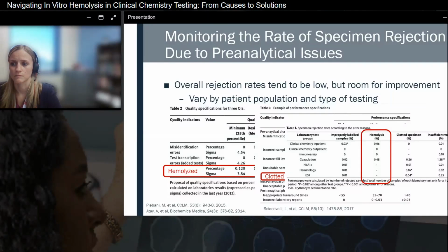This is often just because of the clinical situation of the patients, as well as the more complex specimen collections that have to occur. Oftentimes, inpatients have to be collected by line draws, and this can lead to additional specimen rejection issues. Based on my previous experience, hemolysis tends to be the most common reason for redraws in most patient populations, particularly inpatient populations.